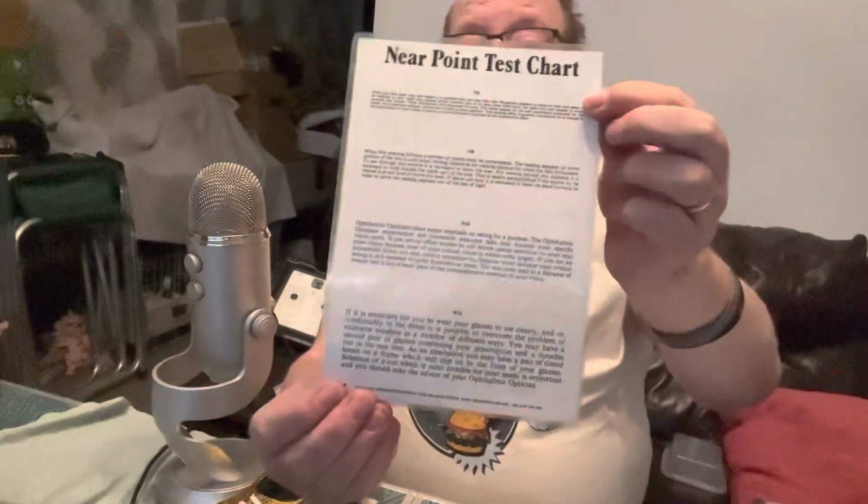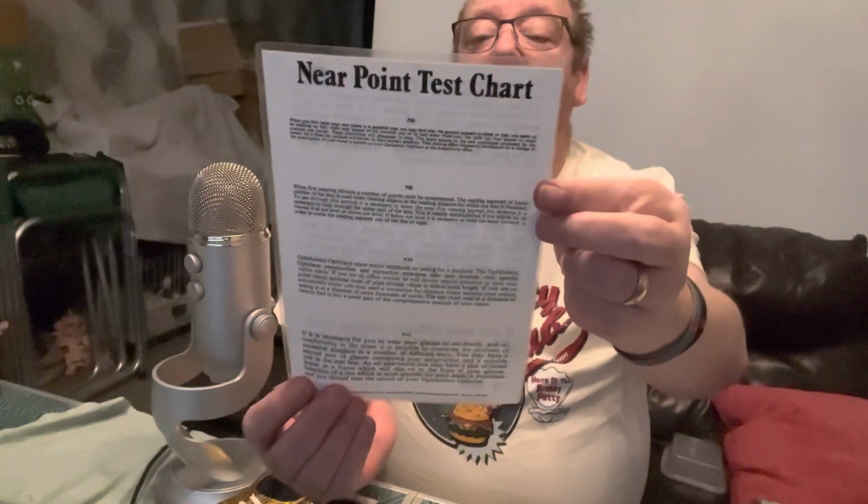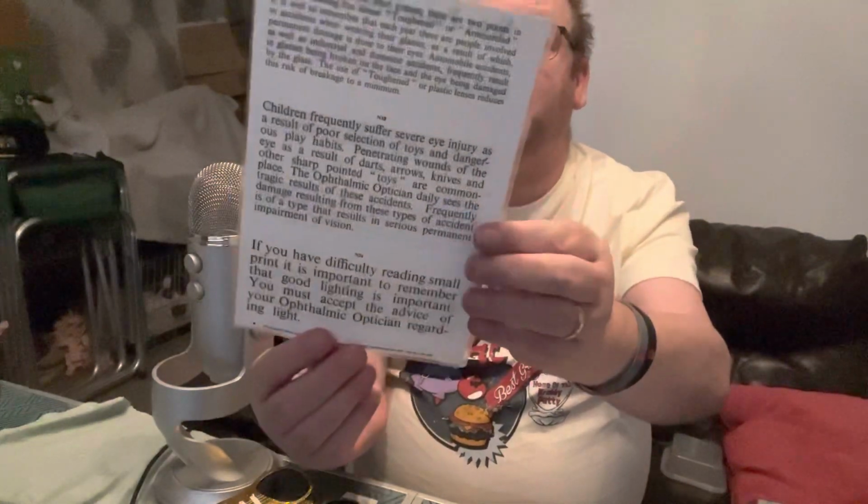And now, as I'm onto this, there are different variations on the near vision chart. You'll see that this one starts with an N6 at the top, and on this page it goes down to N12, and if I turn it round, it's N14 to N24. So it's bigger print if you've not got such good eyesight. So that's just a single sheet near vision chart.